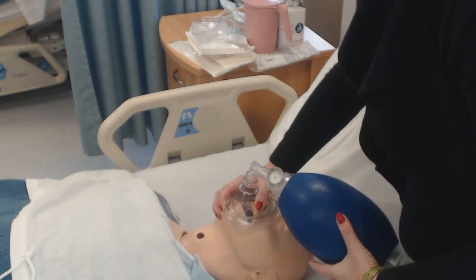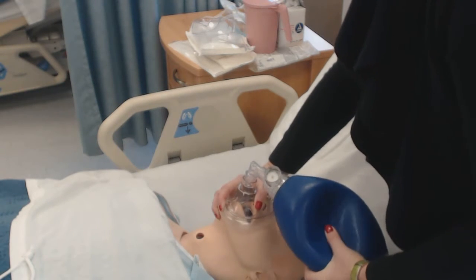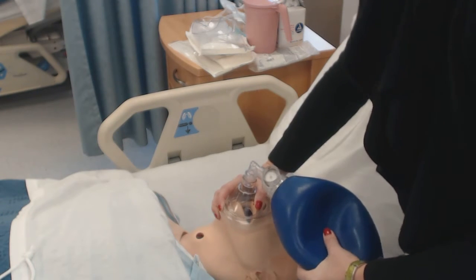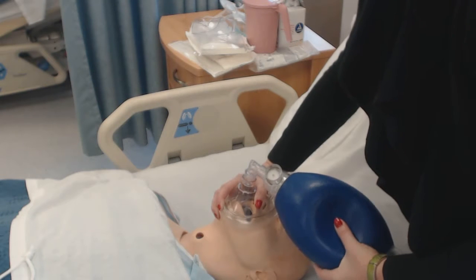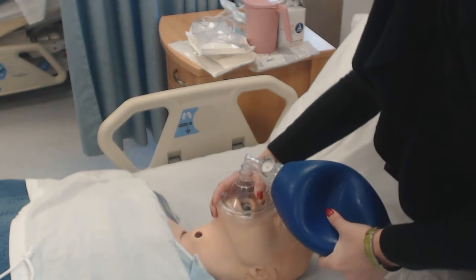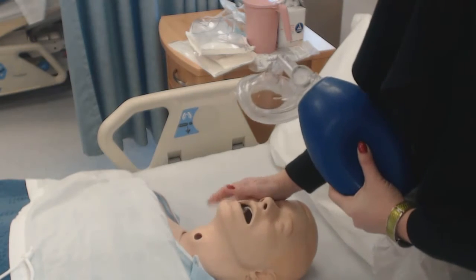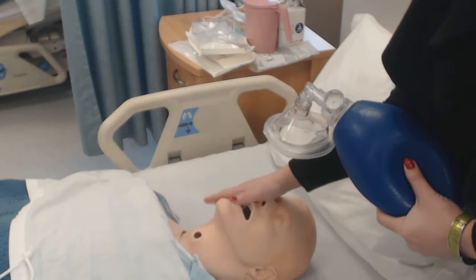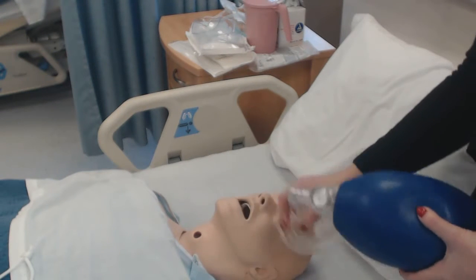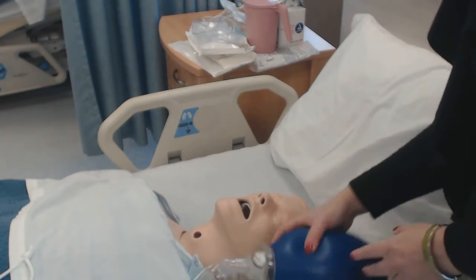Be aware that after 10 to 20 minutes of bagging a patient like this, their abdomen is going to fill up with air and it has to go someplace — they may want to vomit. Make sure your suction is ready and you have gloves on.